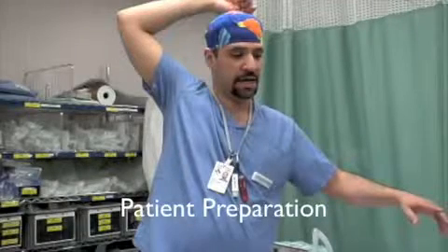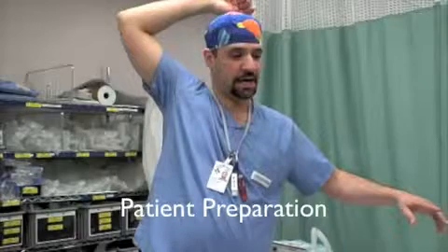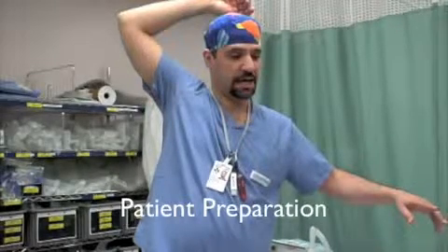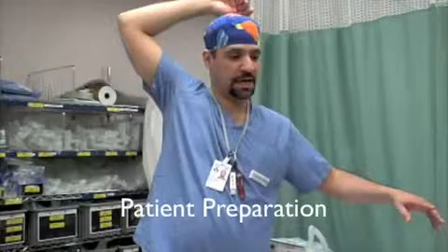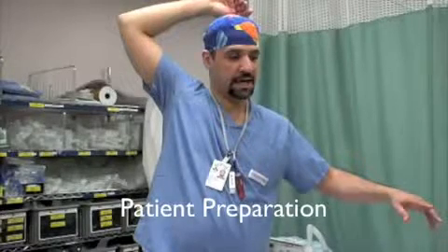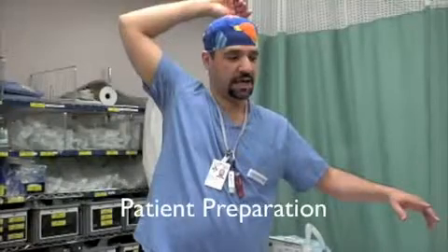Position the patient supine. If patient condition allows, elevate the head of the bed to 30 degrees. On the affected side, place the patient's arm over the head, as demonstrated here. Apply supplemental oxygen, pulse oximeter, cardiac monitor, and BP monitor. Consider medication for sedation and analgesia.